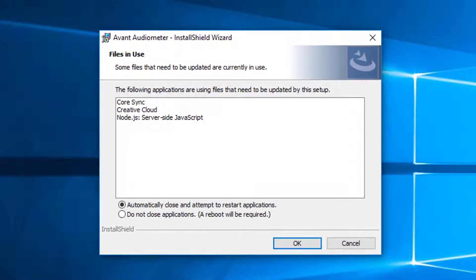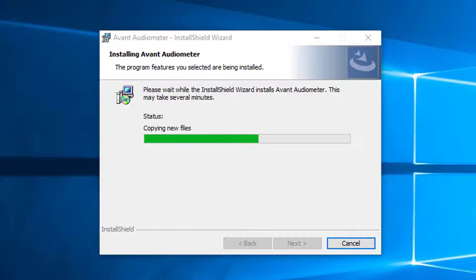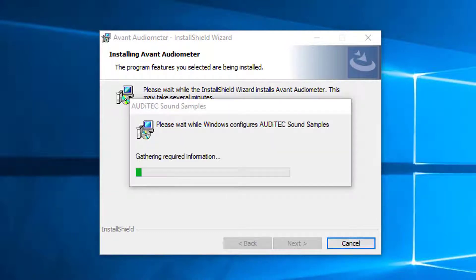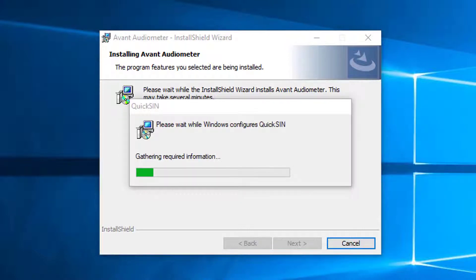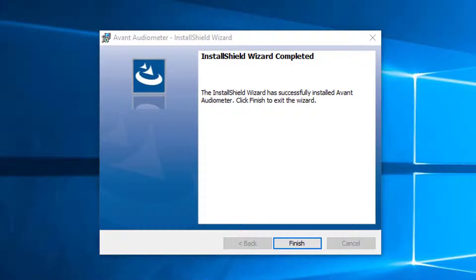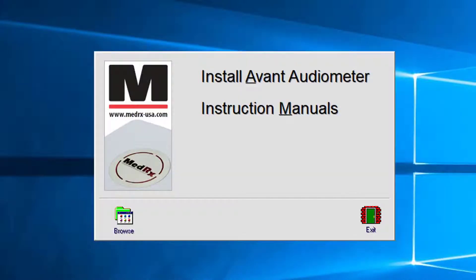The installation is in process. This may take several minutes. When the installation is complete, click Finish. Then click Exit.